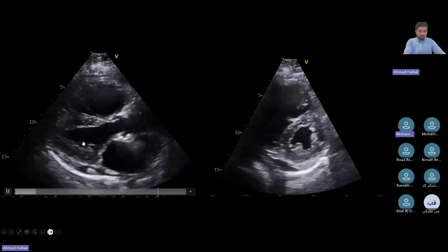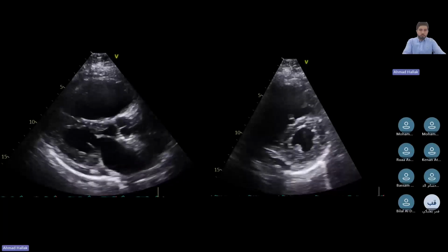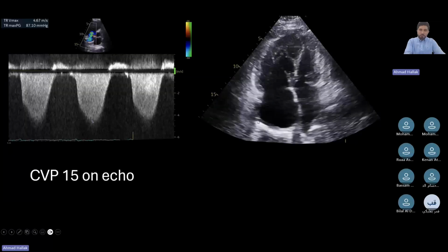Left ventricular. تمام. عم تتمشى مع PE. تمشي مع الPE صح. That's a good point. There's a couple things that you need to consider. In PE, there's two types of PE. There's acute and there's chronic. There's an echo finding on PE that goes more with acute, and I'm blanking on the name of the sign, but it's when you see the apex of the right ventricle is contracting where the rest of it is down, and this patient didn't have this.